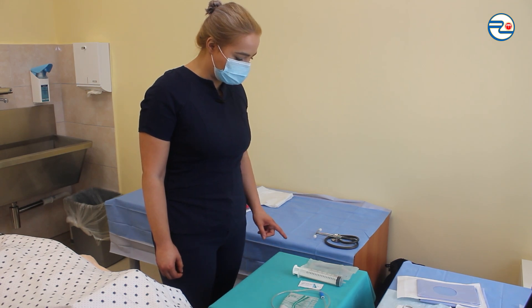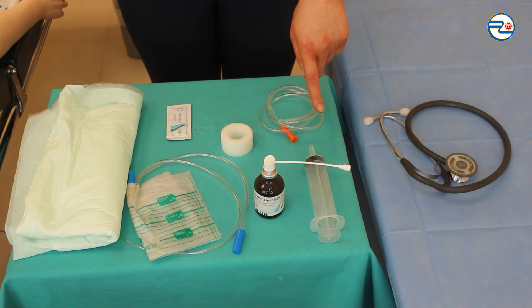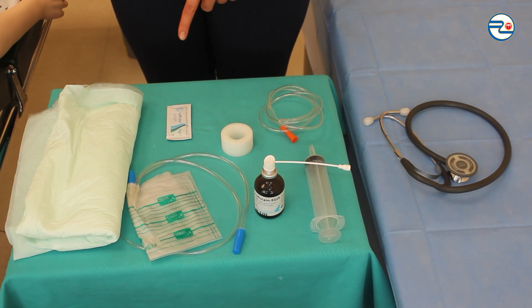Checking if all tools needed for tube insertion are prepared: nasogastric tube, 50 ml syringe, local anesthetic aerosol, plaster, collection bag, lube, disposable drape, and stethoscope.